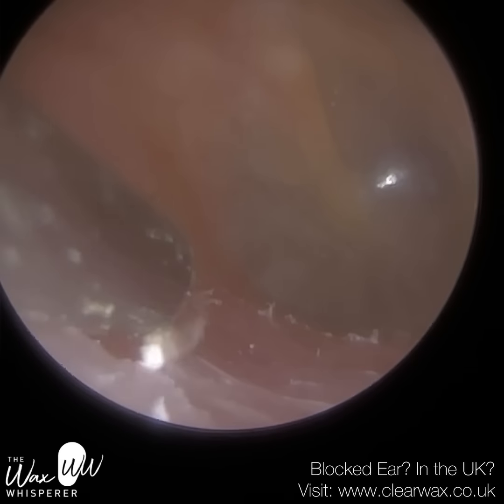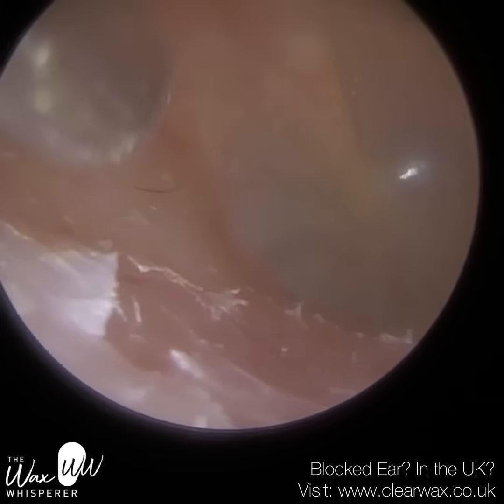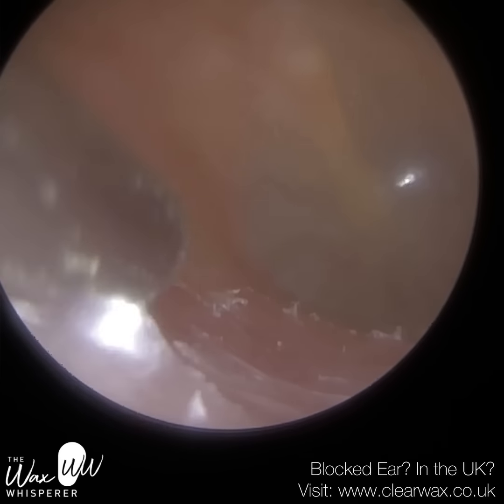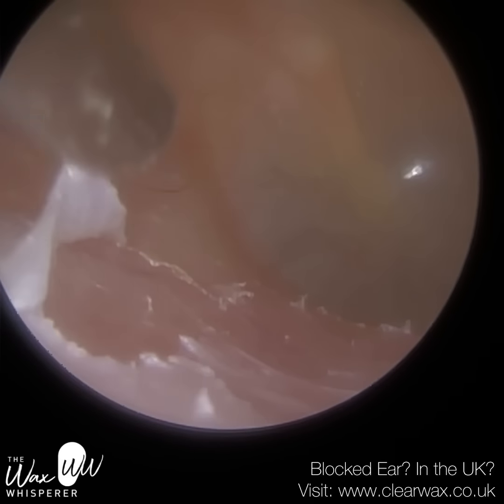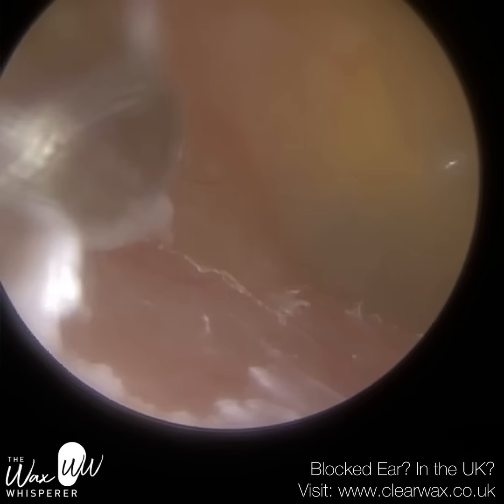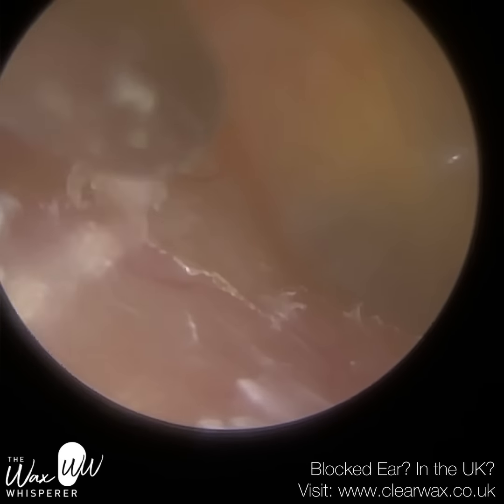And what I've done, I've angled, you may not be able to fully see on the video, but the tip of the fine end, I've angled it, and I've inserted it in such a way where the angulation is going away from the back part of the ear canal towards the eardrum, which is then allowing me to come a bit closer to the canal wall, and minimizing any abrasions, because I'm almost trying to glide.